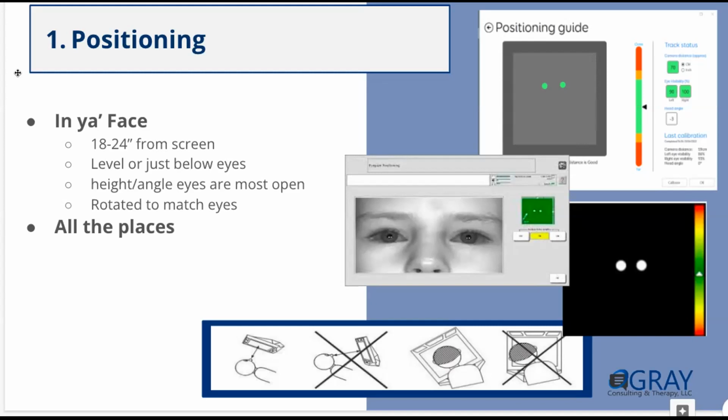So being in a relatively gravity free position, or at least gravity's a little more working with them, like nicely tilted in their wheelchair or in bed, or for some individuals, up in a prone stander so that they're getting support fully up.